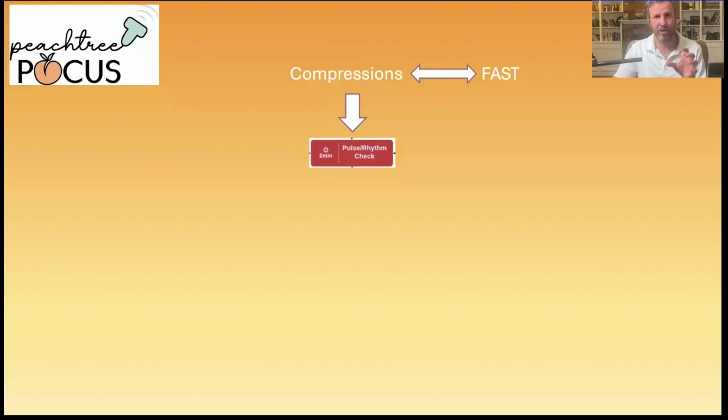So breaking down the pattern is really two things. It's simple. During pulse checks, I look at the structures that require stillness to actually see: the heart, the pericardium, the IVC. During compressions, I look at structures I can assess without interrupting CPR: lungs if you can, DVT, FAST exam. I check for one thing during each component of the algorithm. This way, POCUS flows within the existing ACLS algorithm.